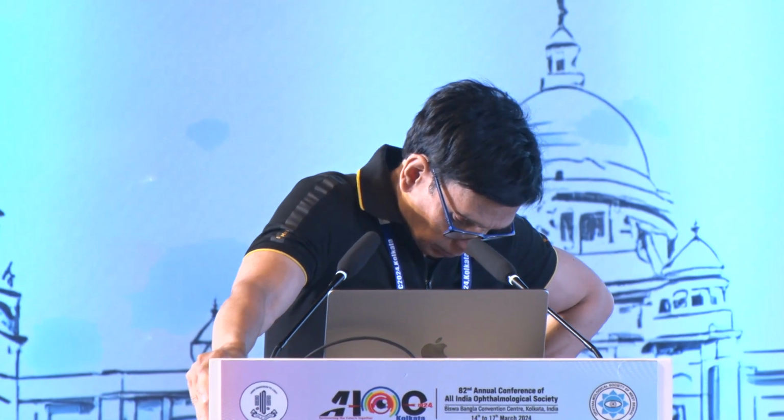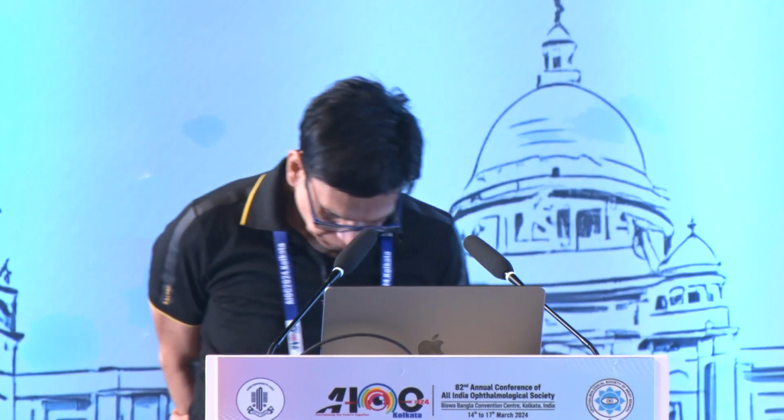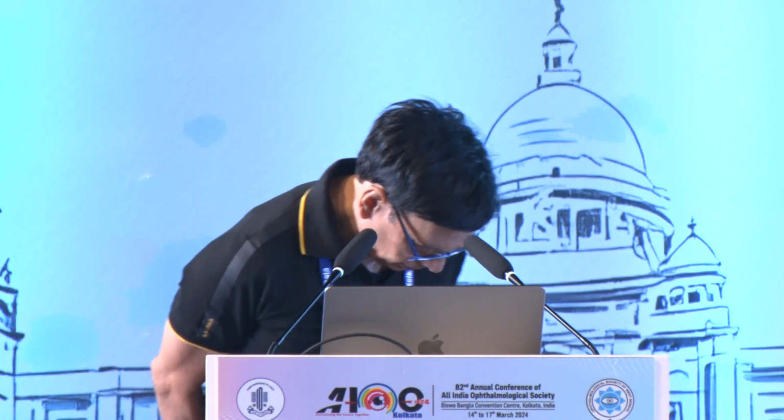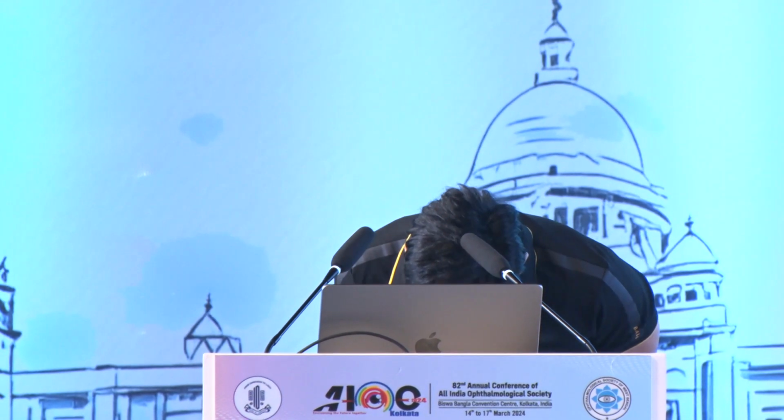The third thing is that, always pick up a 3-piece intraocular lens. You should always have it in your system, especially, see, complications can occur any time during the surgery, but there are certain cases where you can actually predict that, okay, this can go this way also. So at least for those cases, we should have some 3-piece lenses handy out there. Never put a 1-piece intraocular lens into the sulcus. The haptics cause a lot of problems in the post-operative period for the patient.